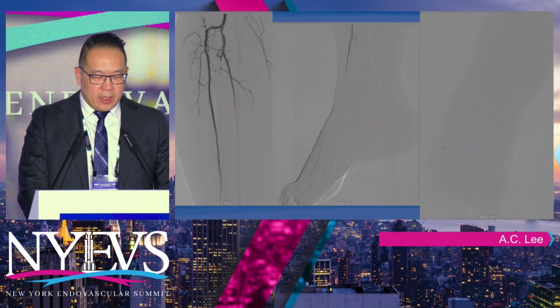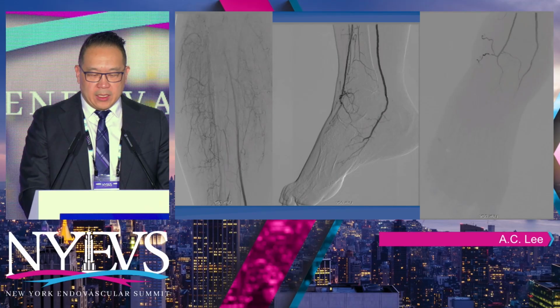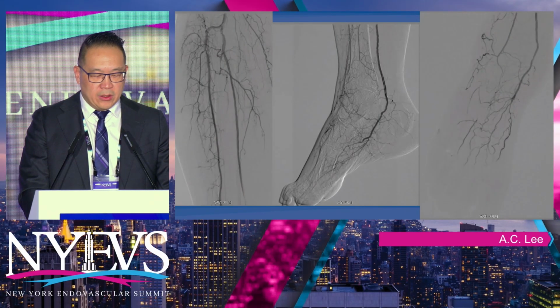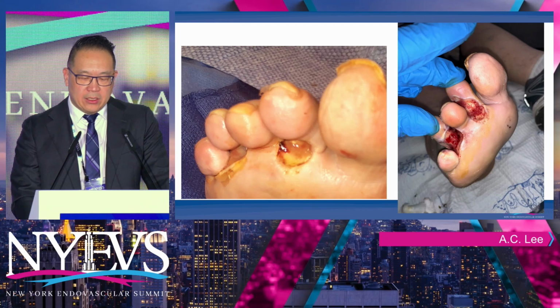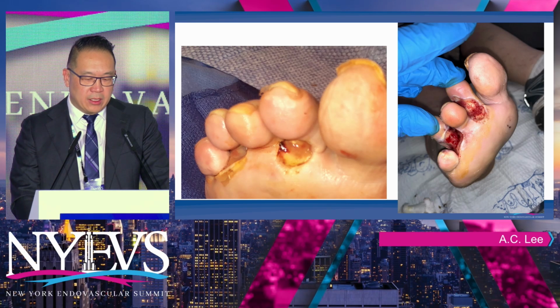So we exteriorize the wire, bring everything antegrade, treat it, and you can see here a nice direct flow to the plantar surface. And 3 days later, she already had granulation tissue.